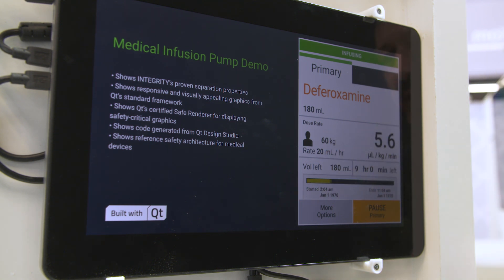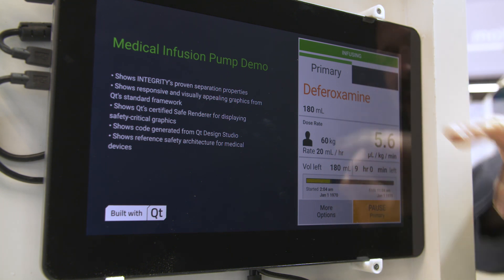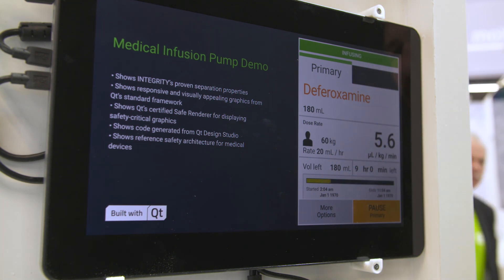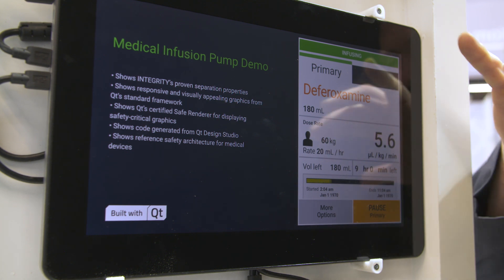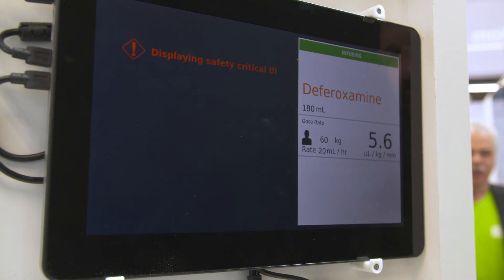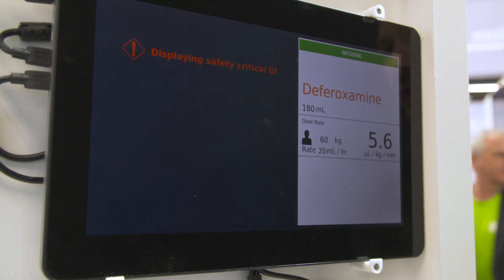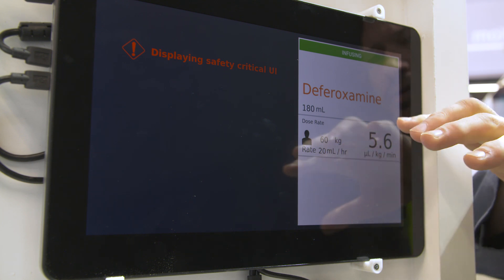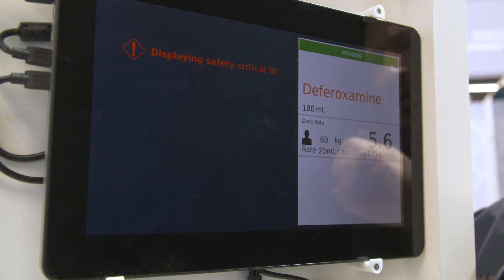This was built with Qt Design Studio, where the UI was designed in Photoshop and then automatically imported into Qt, and the QML code was generated. Now the Qt Safe Renderer has kicked in — we simulated a crash of the software.